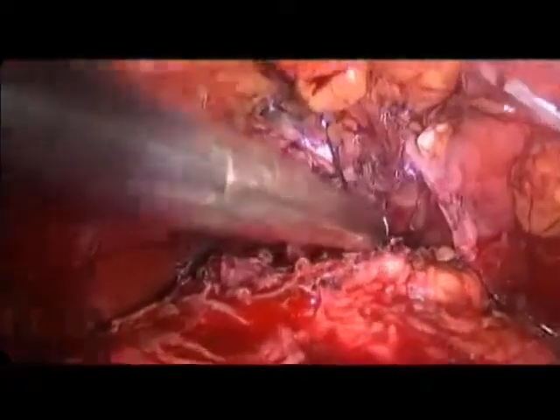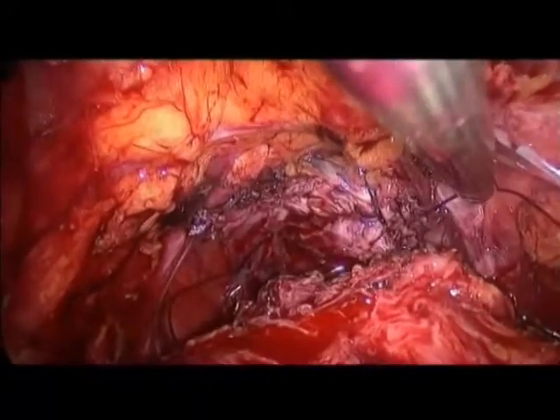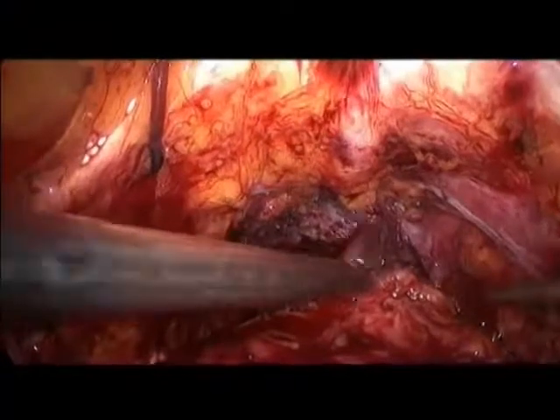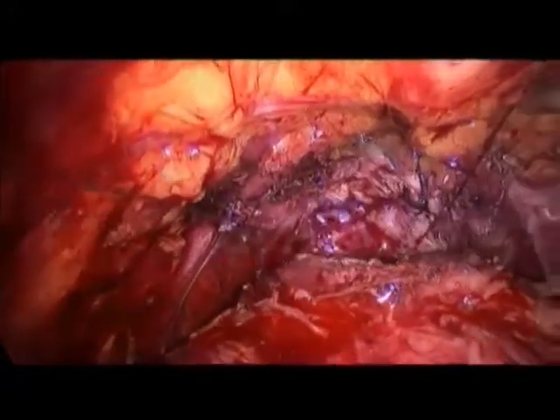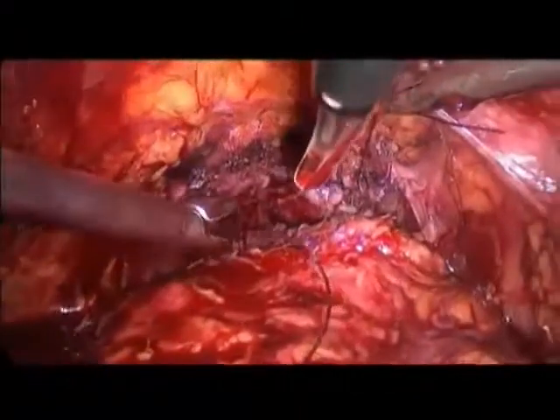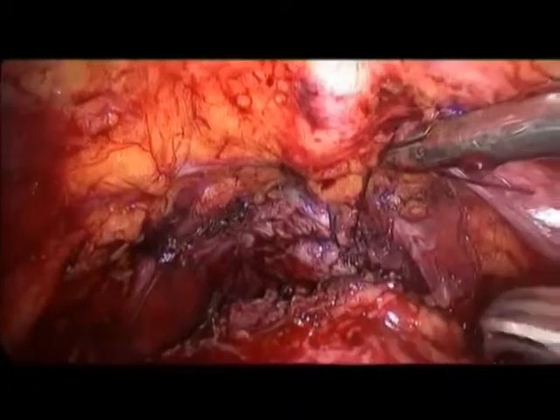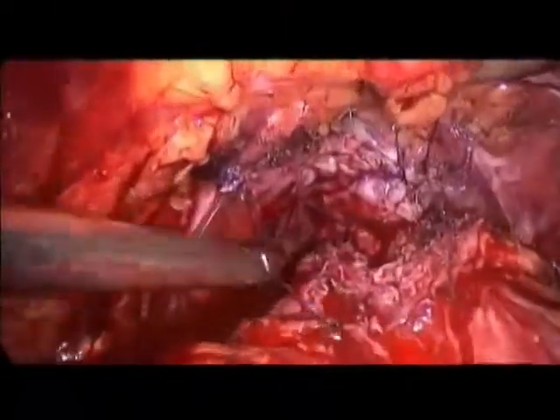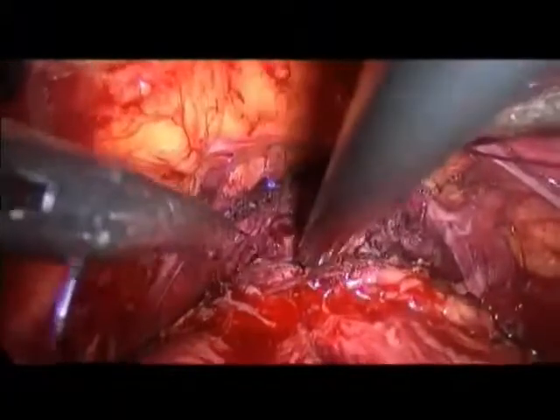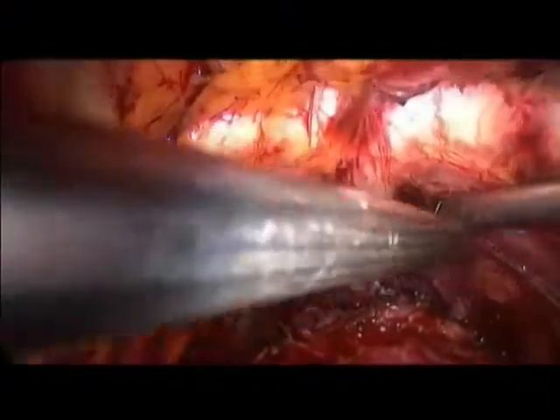But I need to secure these threads with my needle holders. No needle for the moment. Just have him waiting like this on one side. There is a knot, so that we will cut it there. Okay, so the threads are secured so that the traction is optimal on the posterior aspects, and now we will check the arrival of the catheter.